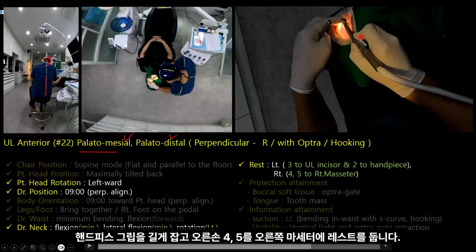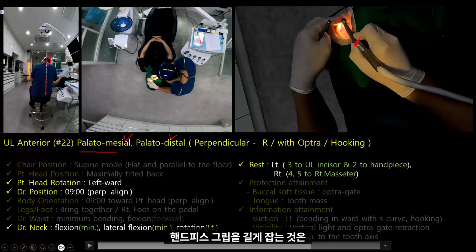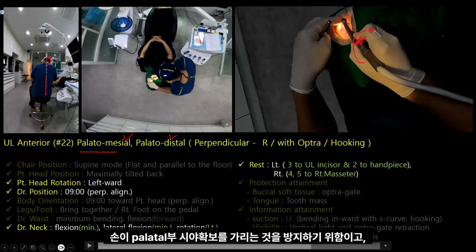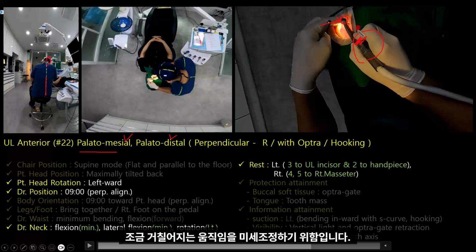Hold the handpiece with a long grip, resting your right 4th and 5th fingers on the right masseter. With your free left hand, it's good to place a rest with your 3rd finger on the labial surface of the anterior teeth and use your 2nd finger to provide auxiliary support to the handpiece. Holding the handpiece with a long grip is to prevent the bulk of your hand from obstructing the palatal view. Also, providing auxiliary support to the handpiece head with your left hand helps fine-tune the slightly rougher movements that can happen when gripping the handpiece with an extended hold.